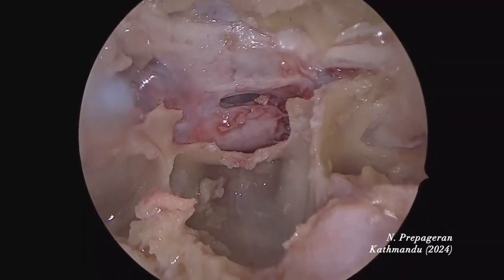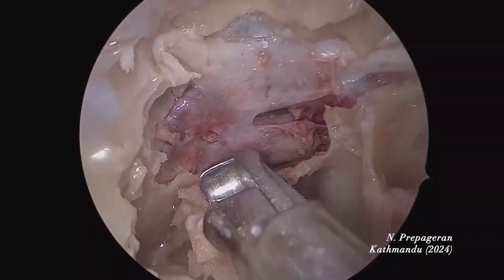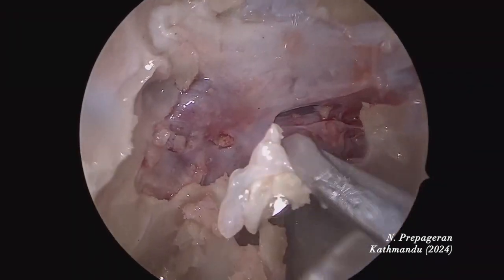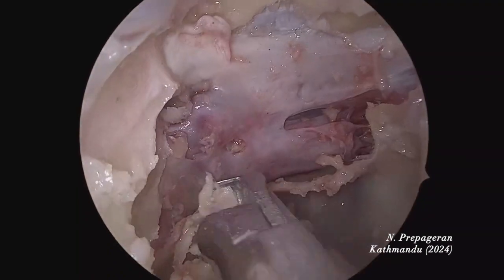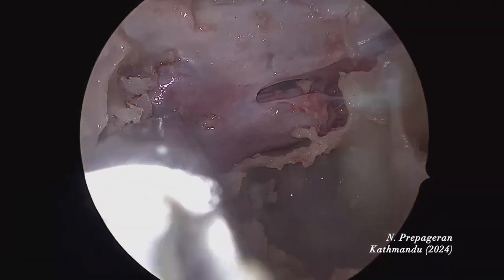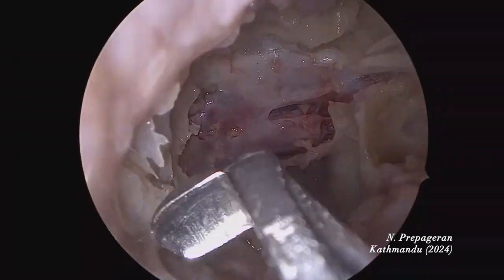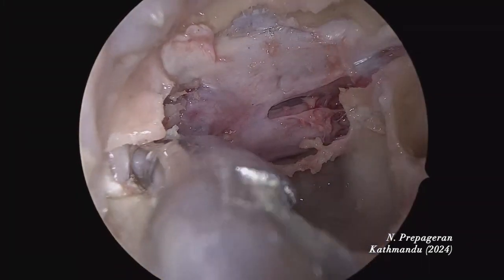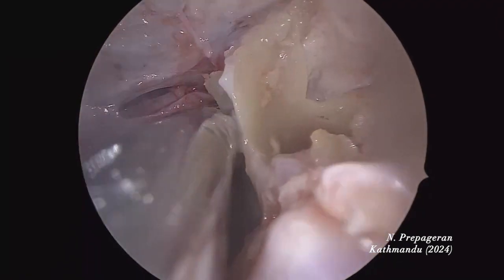The cavernous sinus is coming into view on the opposite side. Now I'm going to the cavernous sinus region. You can see we are doing the entire dissection with one instrument — what is this? A sphenoid punch. An Indian-made sphenoid punch. It's hard bone — not a normal bone. Now I'm going to go laterally.